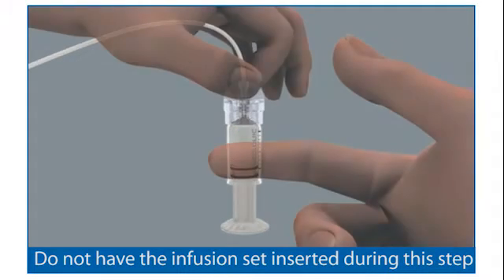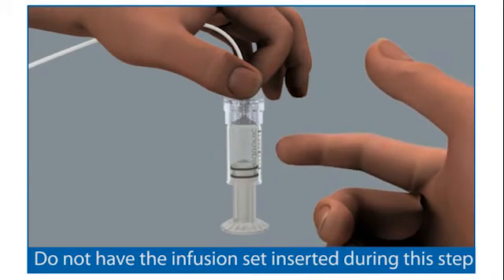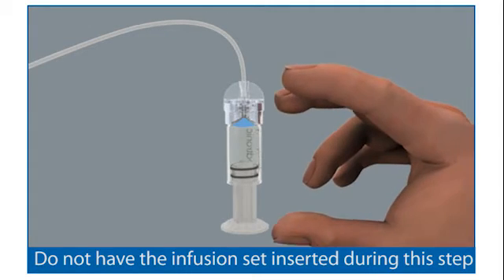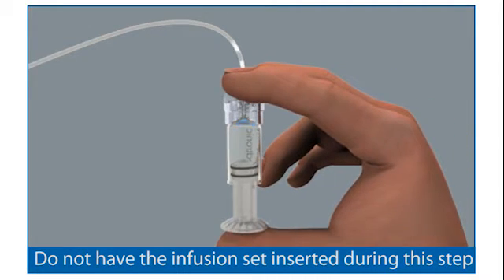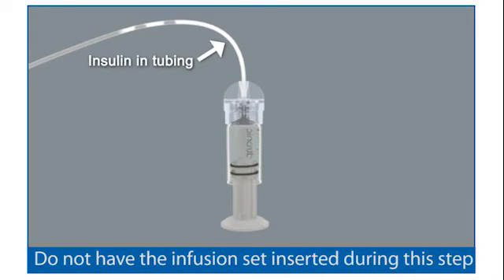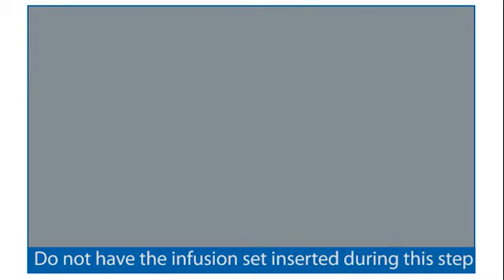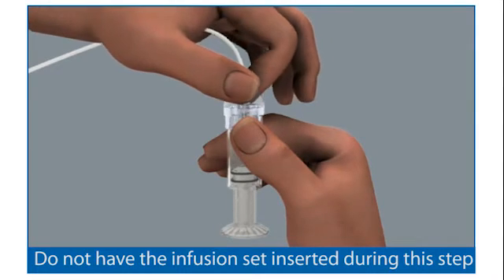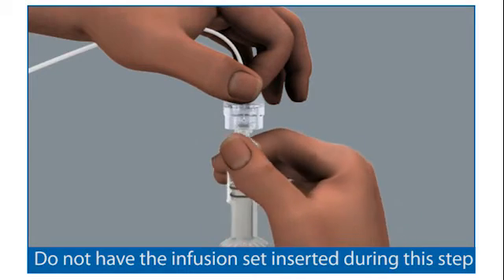Tap the reservoir to make any air bubbles rise to the top. Purge the air bubbles that have risen to the top by slowly pushing up on the plunger until all of the air bubbles have been pushed out and you see insulin in the tubing. If you are not able to push insulin into the tubing, disconnect the reservoir connector and then reconnect it.